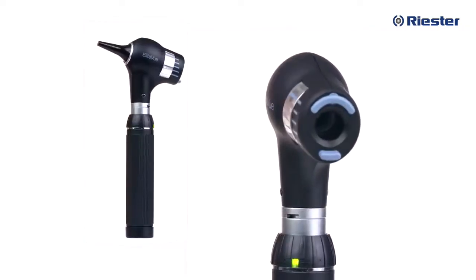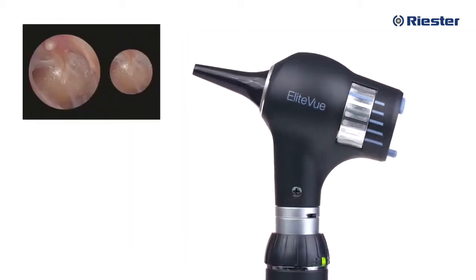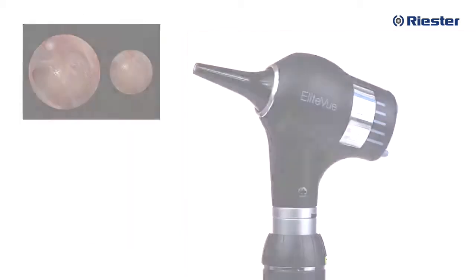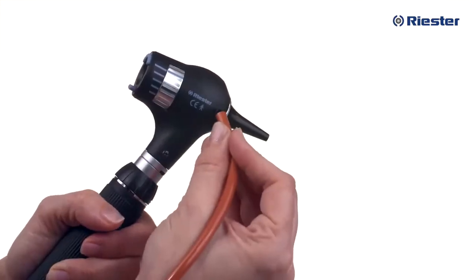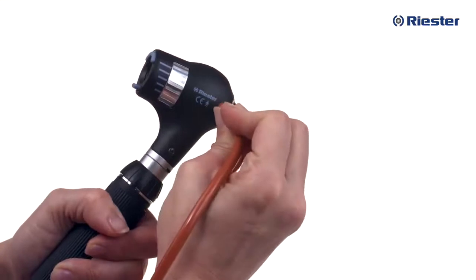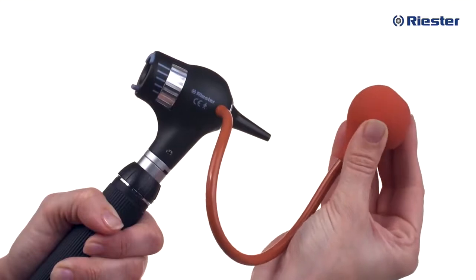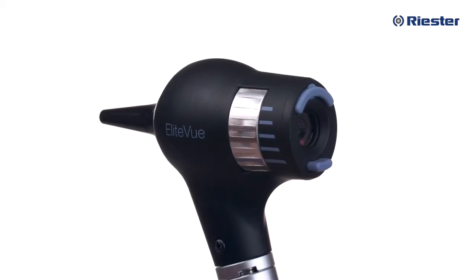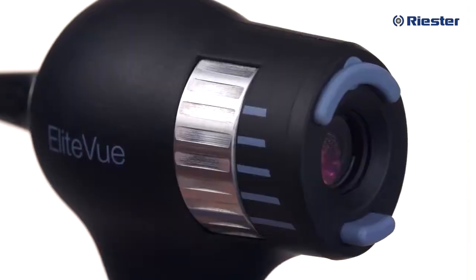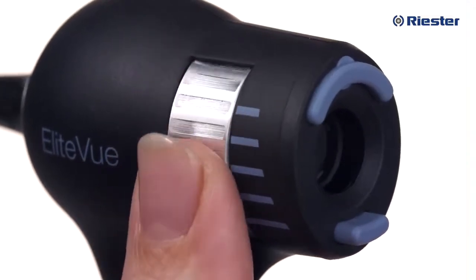Combined with an increased field of view and increased magnification, the EliteVue allows for a complete view of the tympanic membrane. The lens of the EliteVue is greater than fivefold and is a fixed lens. Standard to all Riester otoscopes, there is a built-in connector for attachment of the insufflator bulb for pneumatic otoscopy. Finally, the EliteVue macro otoscope includes a focusing wheel to adjust focal depth. While examining the patient's ear, simply use your finger to adjust the focal depth to your preferred setting.